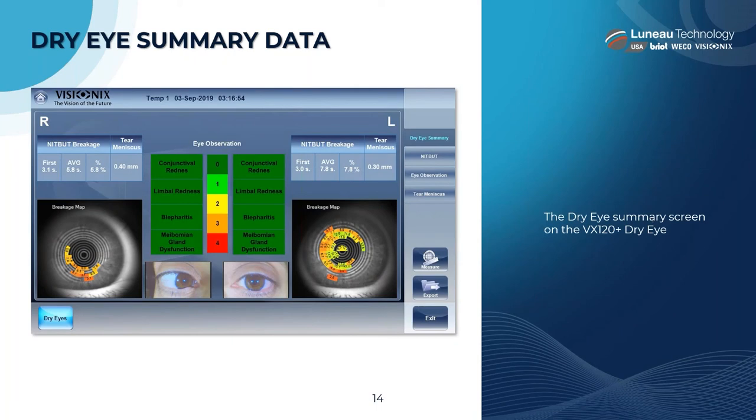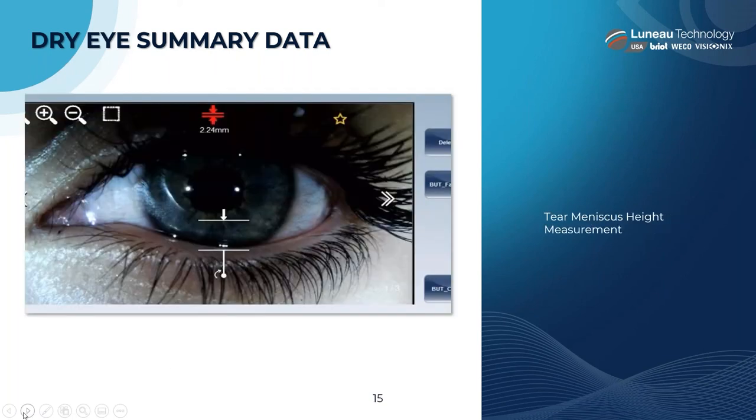Here's the dry eye summary screen. It's got limbal redness, conjunctival redness, blepharitis — all measurement scales are there, including meibomian gland dysfunction. You can see the patient's eyes, you're storing all of this data to look back at later, along with the tear meniscus height and measurements.